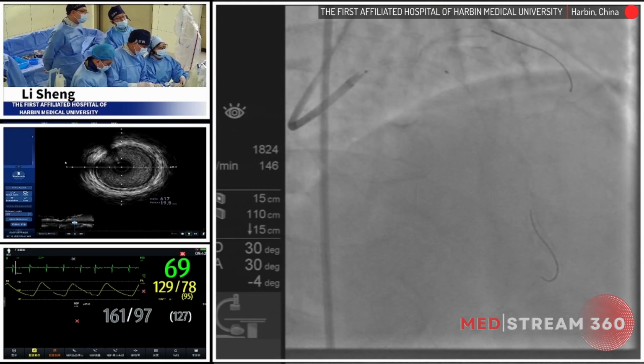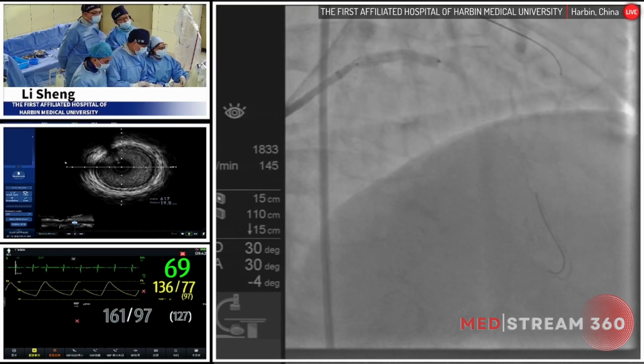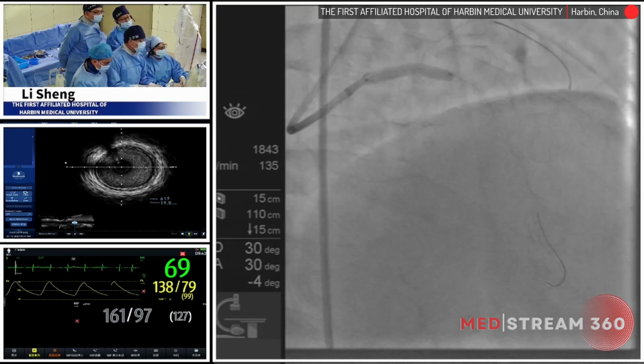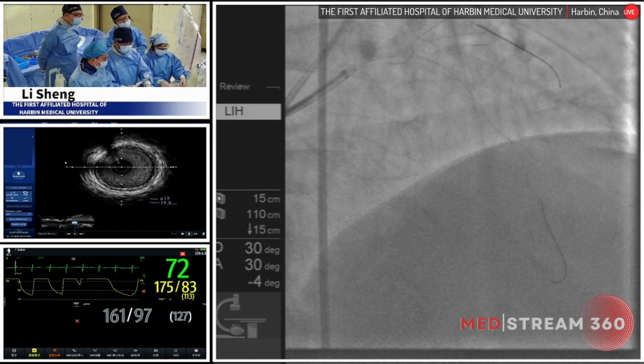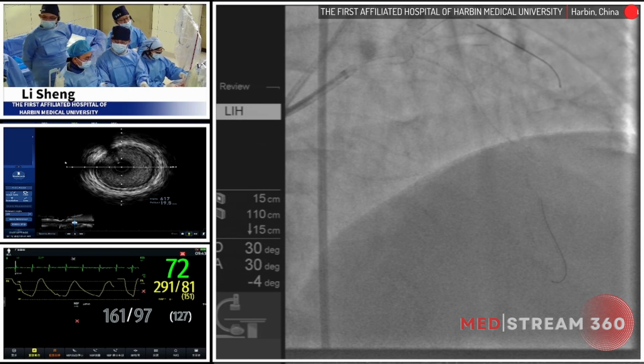That's what you mentioned before. The calcified plaque influences the stent expansion. I see, because some parts of the stent are not well expanded. Slow. Yes. This time we could perform QFR of the circumflex.